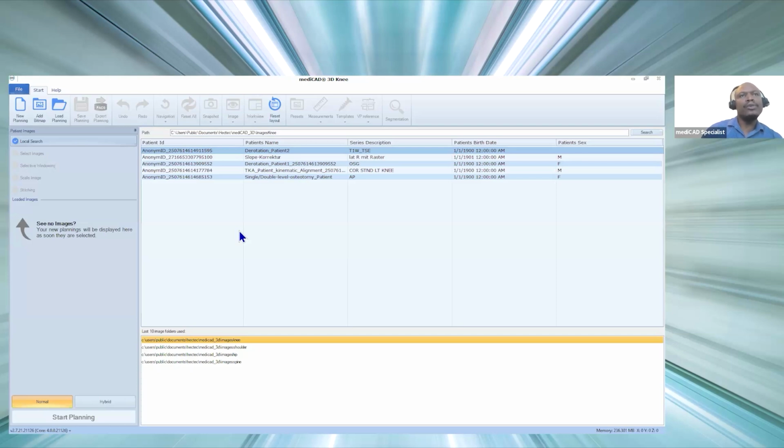So basically, if you are currently working with a templating company, I'm 90% sure, or higher, 99% sure that it's already in our system. And if you add a new templating company or change templating company, you'll find it in there. That's the main benefit of having all these different manufacturers in there, because most planning companies don't have that. You have to plan with another brand, right? But you'll be planning with the one that you currently use.